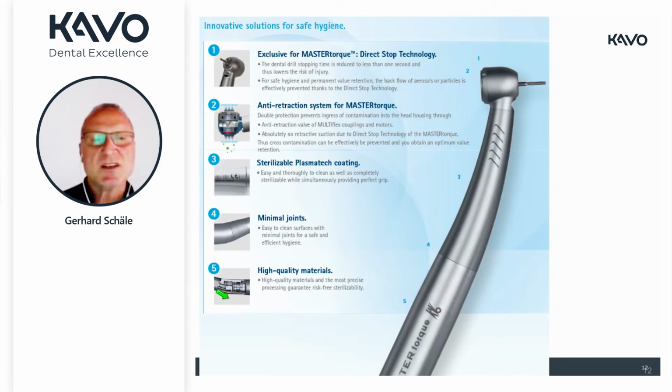Everyone knows this kind of coating from daily life, when we talk about Teflon. Teflon, especially in the kitchen, makes the cleaning after use very easy. And that's exactly what we want to have here.